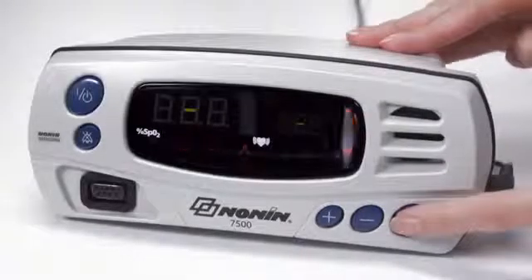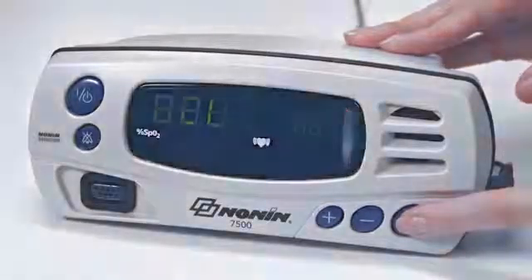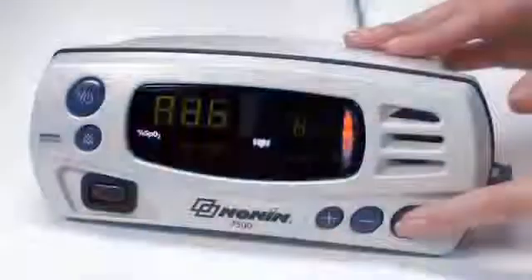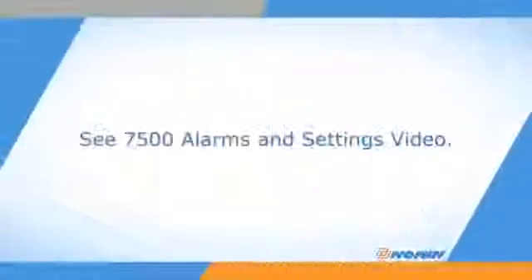It is recommended to set and check alarm limits and other oximeter settings prior to each patient use. The oximeter comes with a default low alarm setting of 85% SpO2, a high pulse rate of 200 beats per minute, and a low pulse rate of 50 beats per minute. These may be customized in the setup mode, explained in the alarms and settings video for this oximeter.